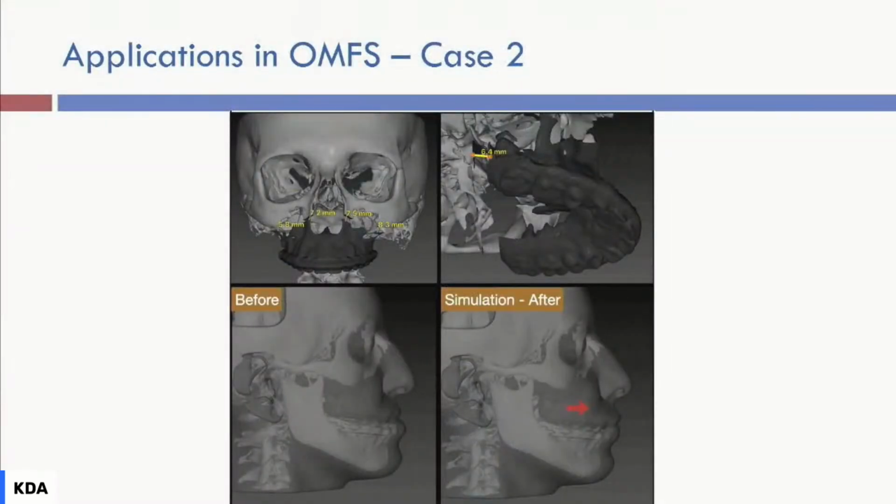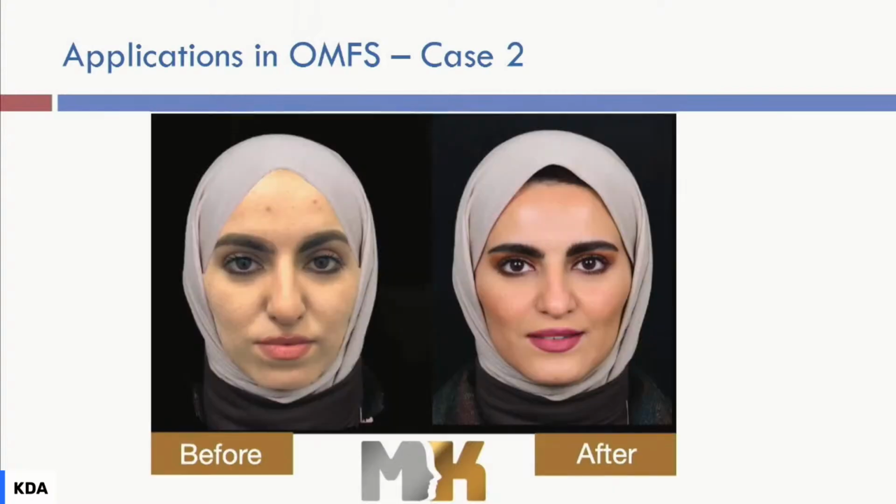So I decided that the patient will undergo only a single jaw surgery based on the planning. Without that, we would have gone to the conventional treatment, which is advancement of the maxilla and setback of the mandible. But when you have a proper 3D picture of the patient, I'm talking about the soft tissue, then you can predict every move, then you can take more radical actions and rely on a single jaw surgery to come up with the results. So advancing the maxilla and relying on it to advance the whole nasal complex to get an improvement in the midface. So let's look at the pictures.